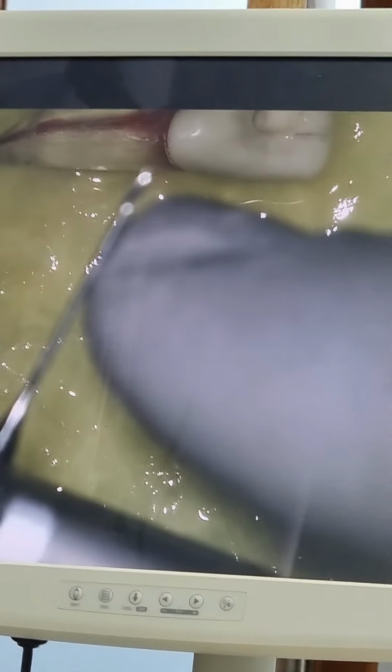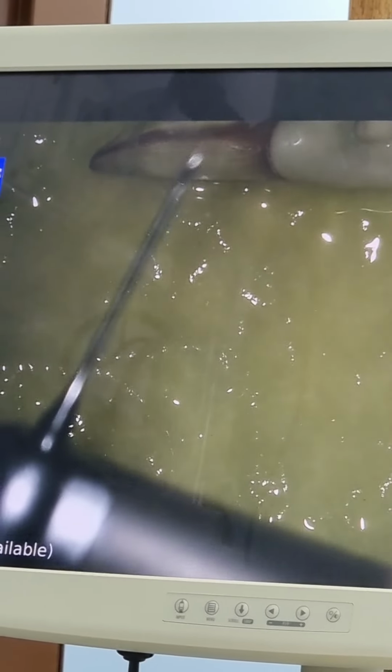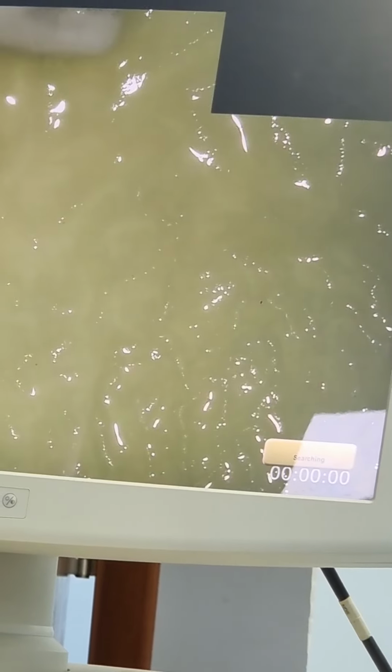These are not designed to use at high speed. You see the design? So fragile, very thin and narrow. If you use it at high RPMs, it will get engaged in dentin and then it will break. So you have to adjust the RPMs. Around 1000 RPM, just higher than a slow speed, is fine for the Gates Glidden.